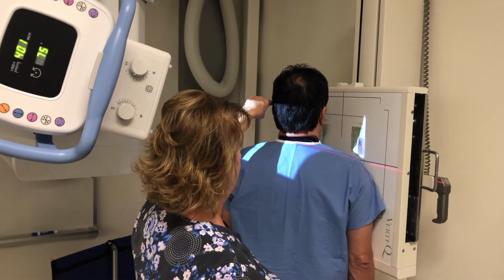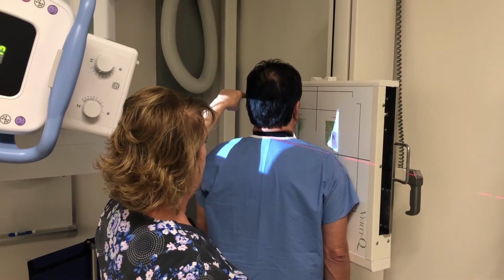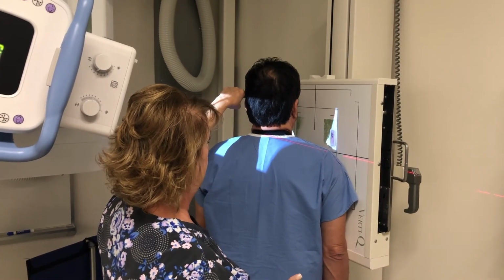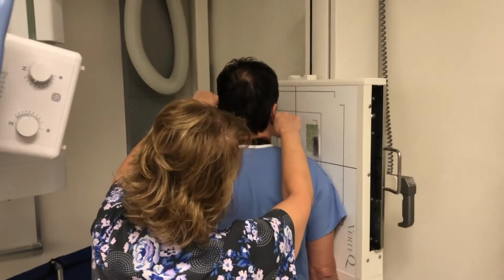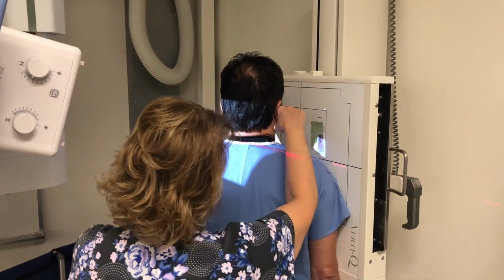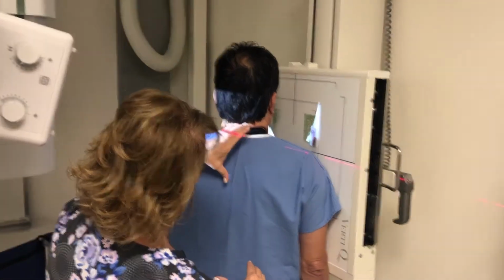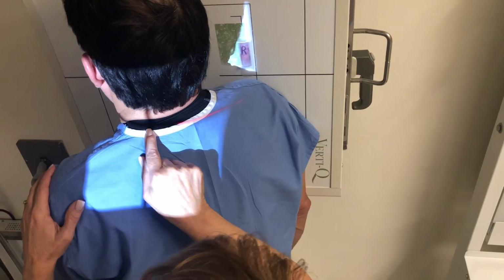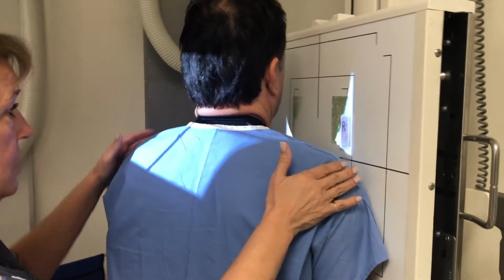I've got the upper border of the film. I'm starting about the level of his ear there, and at 15 caudal, I'm ending about right here at the EAM, but it's projecting his spine downward, and so it looks like I'm entering a little bit low here, but it'll be positioned fine once that projection carries the image down.